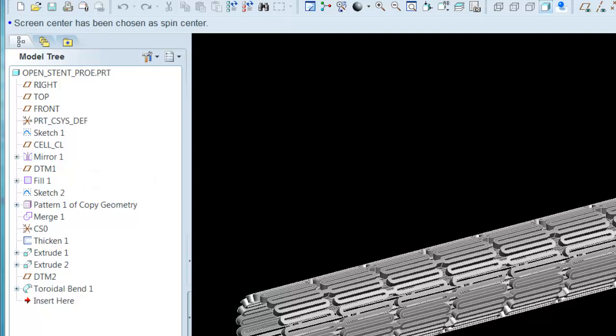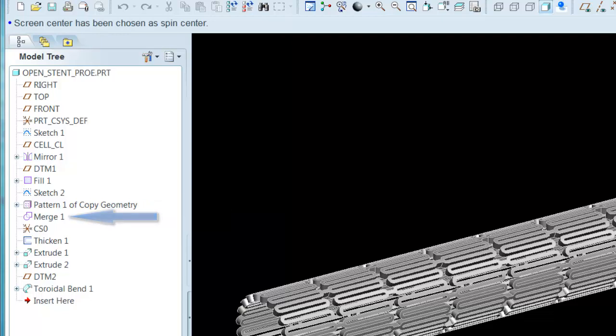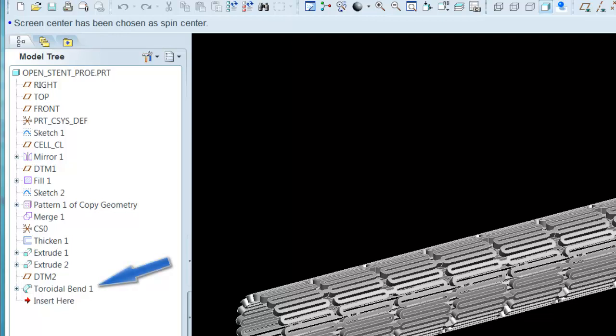This surface is patterned in the x and y directions and these patterned surfaces are merged and thickened to produce a flat solid. After a bit of cleanup, the flat solid is rolled into a cylinder using the toroidal bend feature.